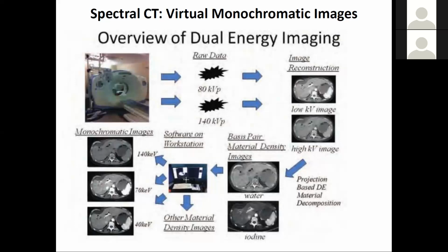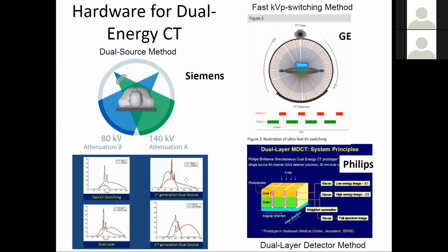So there's a number of things you do with dual energy that you cannot do otherwise, but it takes a fancier machine. So it hasn't exactly taken off where everybody's doing everything on dual energy. It's not likely to do that. As usual with CT, people don't sweat the quantitation to the same degree. They'll take their approximations, just give you resolution of small features. So dual energy has special uses, and there are different ways to do it. You can have fast kVp switching.